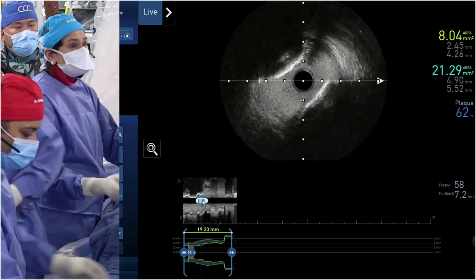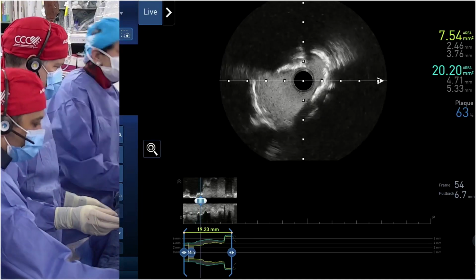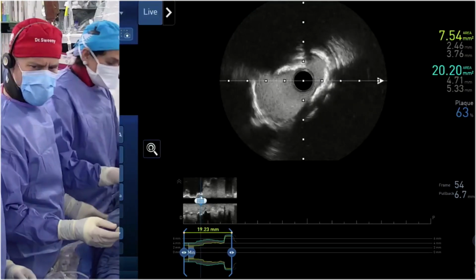Once again, because you're not dealing with a stent, you're not dealing with a lot of circumferential OCT. It is better in showing us what's happening and how things are modified. It's harder to see with IVUS, but I think this is good. The area is 7.5.